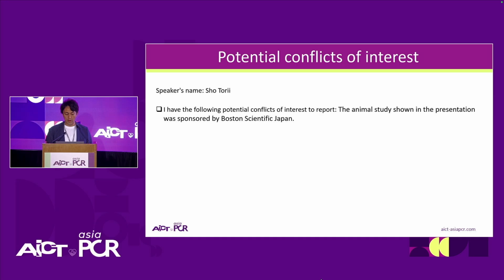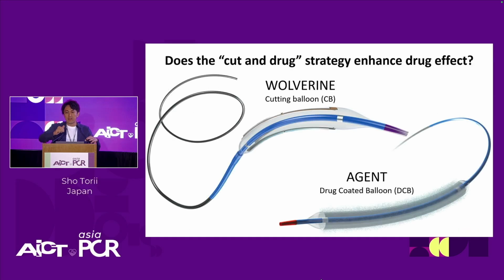So this is my COI. The concept is cut and drug. If you use a cutting balloon and cut the surface of the vessel, and after that we use DCB.